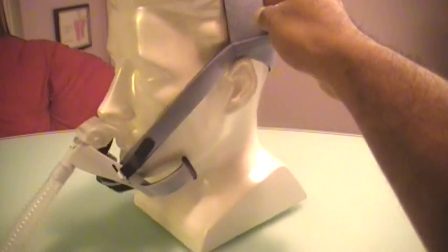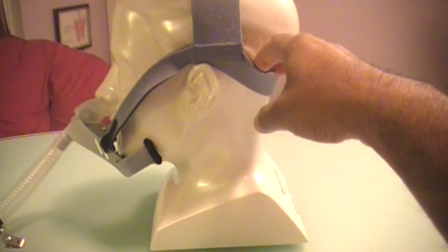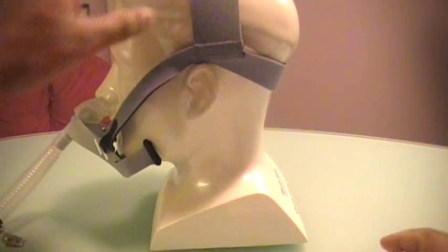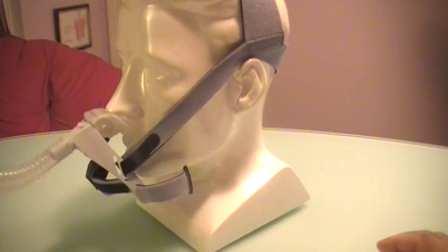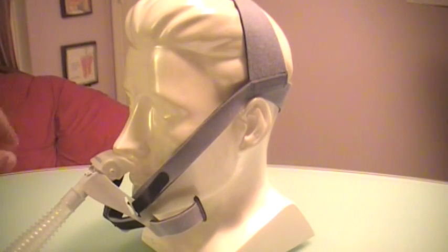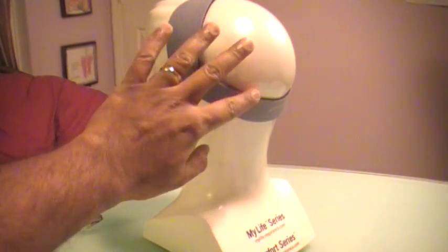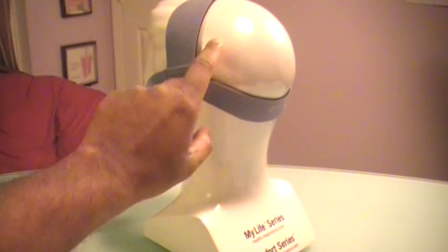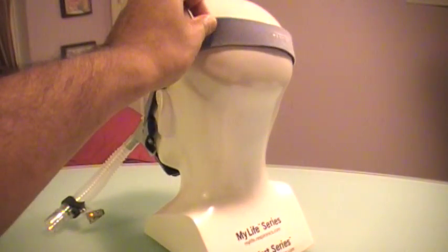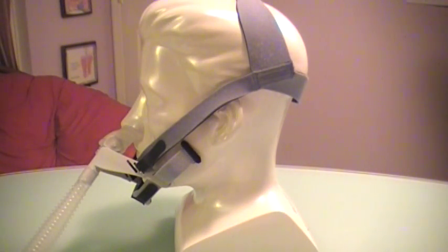The drawback on the headgear is one size fits most. One of the drawbacks of this is you cannot put the tubing to go over the head. There's no way for it to do it. There's a lot of people who like having their tubing go over the head, which is a negative. The other thing is, I have had a lot of patients who have soft, silky hair. This tends to slip off their head very easily. So that is a negative.